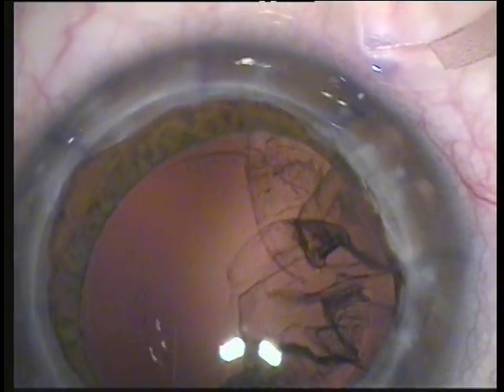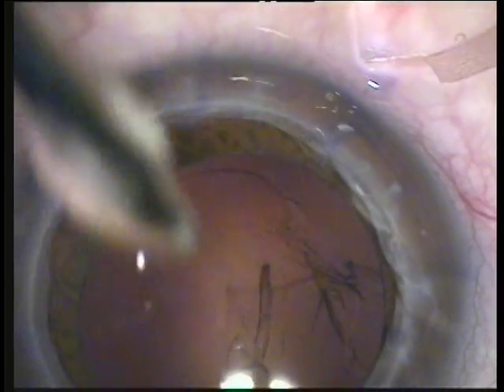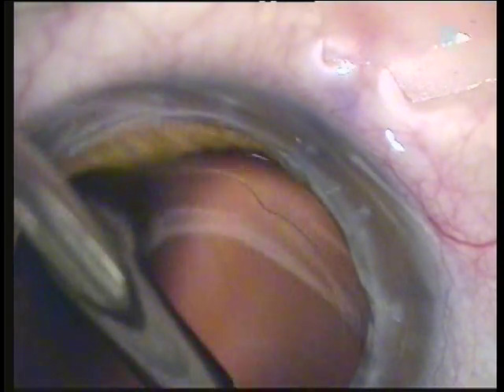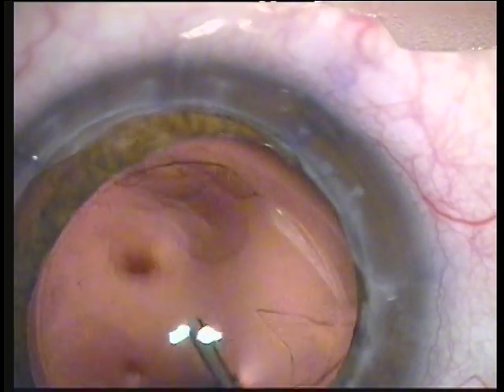This is really a perfect case — the cortical material is coming out quite nicely. We're teasing the cortical leaflets present in the capsule bag and engaging them into the irrigation-aspiration, meticulously removing all cortical material — a step that will provide us with a minimal chance for posterior capsule opacification, at least in the early postoperative period.